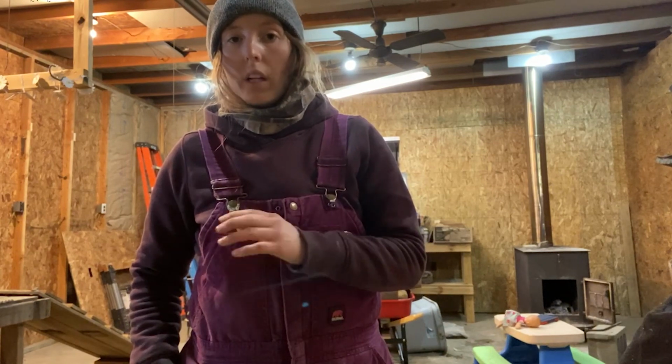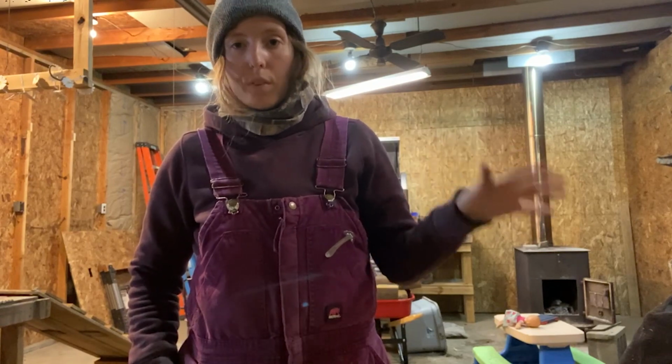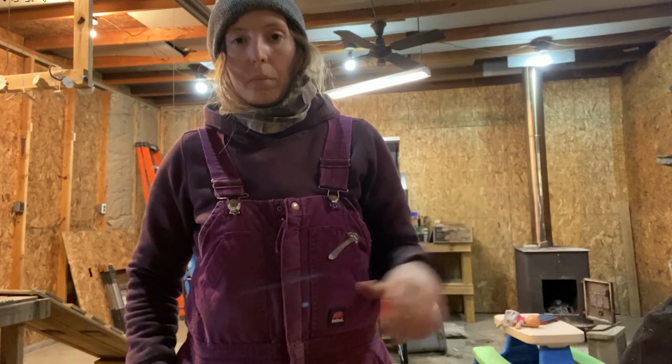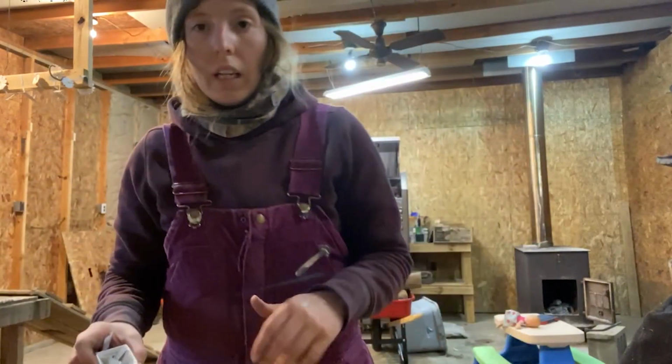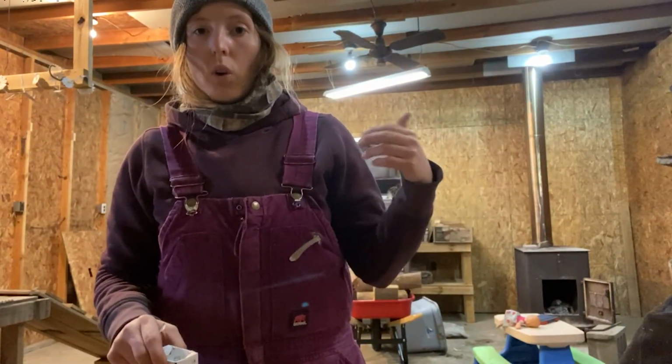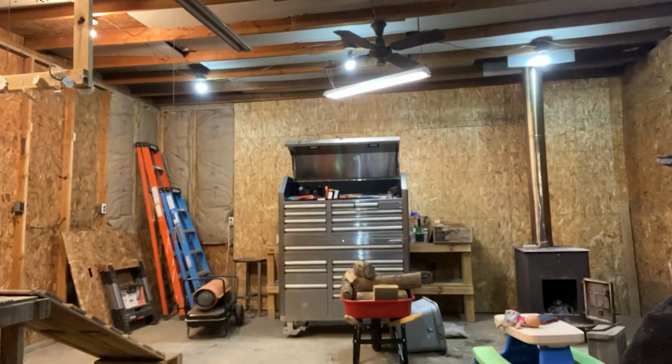So the lab that I use, primarily UBRL in California, requires 1 milliliter of blood to run all the biosecurity panels. Theirs is a lower volume, and I've never had any issues with them not having enough blood to sample things. So the things that you're going to need once you figure that out, you'll go ahead and print off the lab sheet.